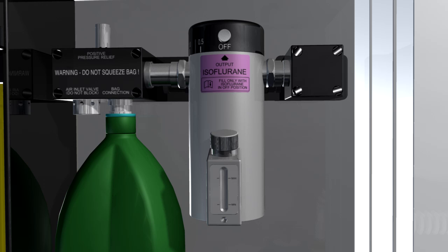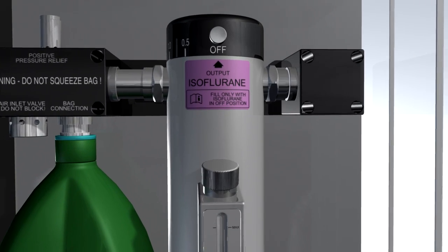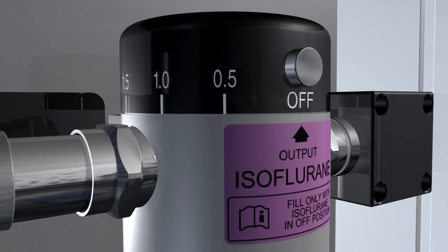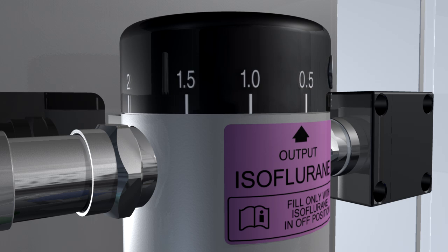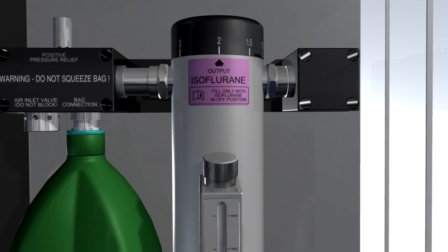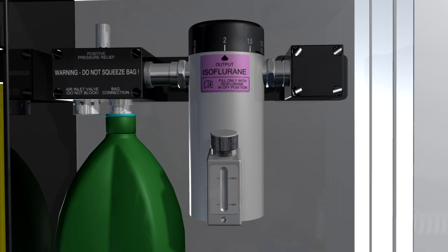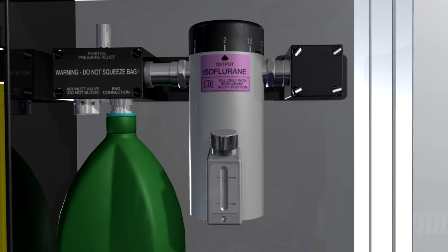The low resistance draw over vaporizer adds volatile agent to the carrier gas passing through it. Volatile agent is added by using the selector wheel to achieve the desired percentage. We now have anesthetic gas comprising oxygen, volatile agent and a variable amount of room air.